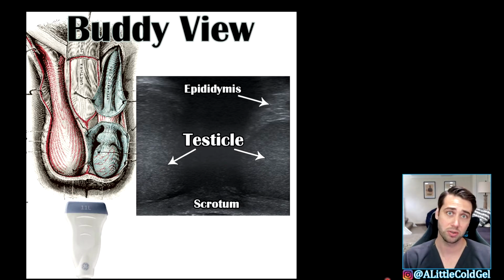And this brings us to another point that I think is kind of a reason that we don't do a lot of testicular ultrasound in the ED, and that's patient setup. So to set up to do the scan, I actually take a towel and put it under the patient's scrotum, and then I put another towel on top that covers the penis and the majority of the scrotum, so that really there's only a small exposed area that the probe's in contact with, and that's definitely sufficient to do your ultrasound exam, and then you're comfortable and the patient's comfortable while you're doing that test.